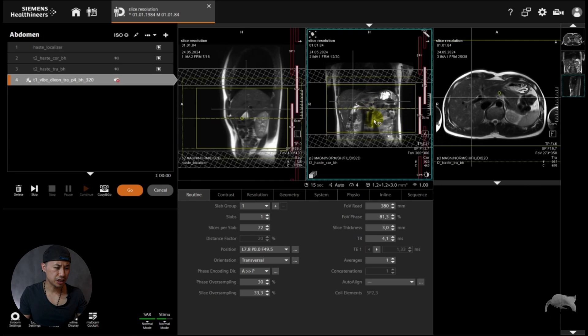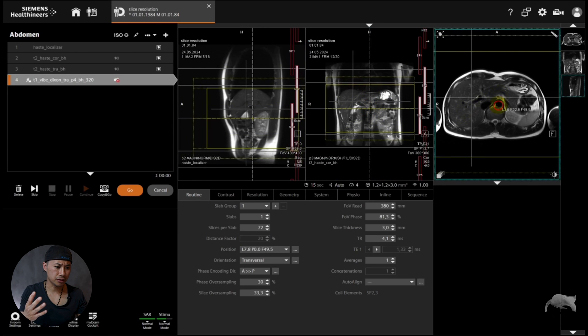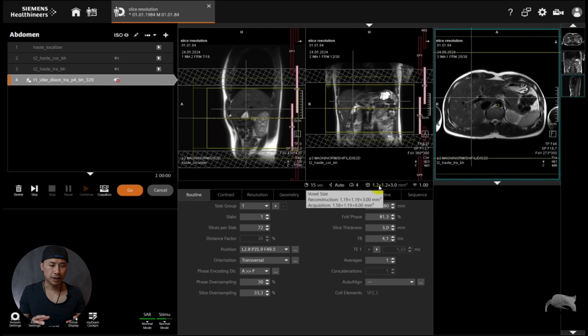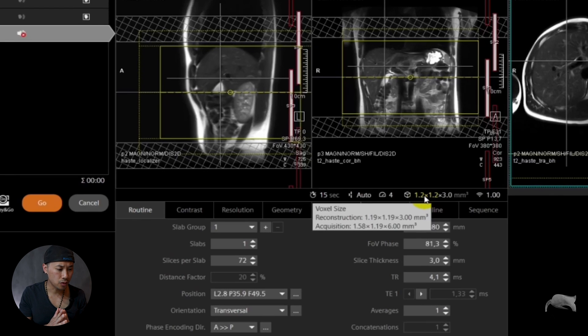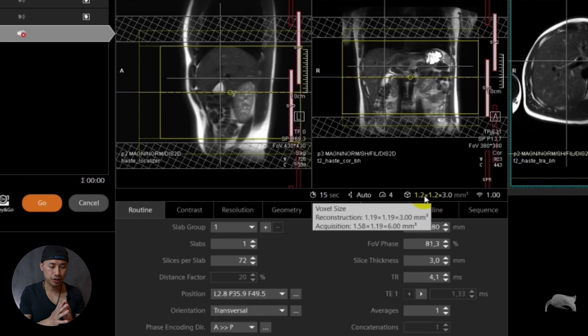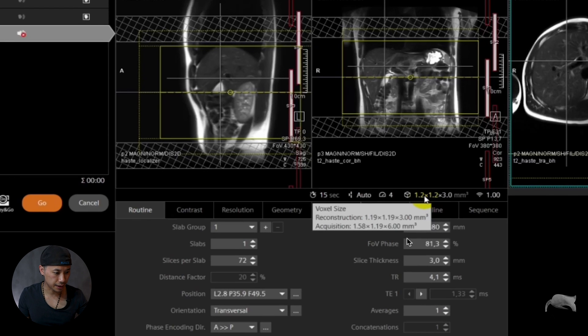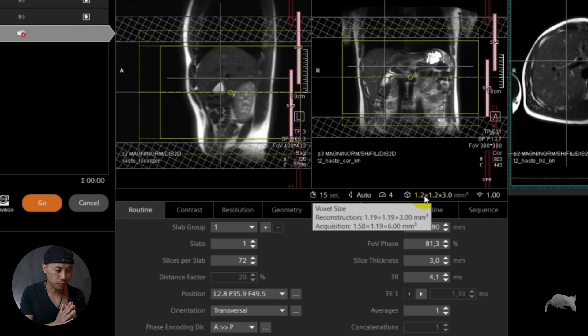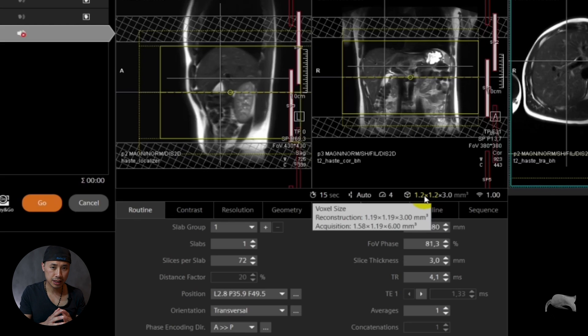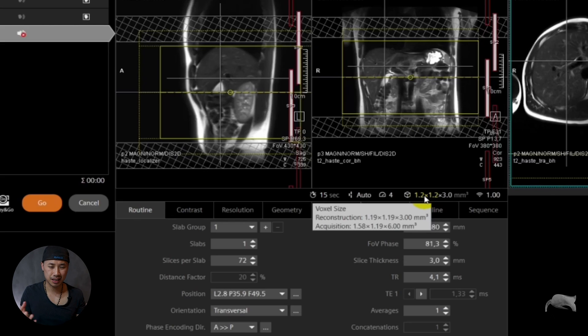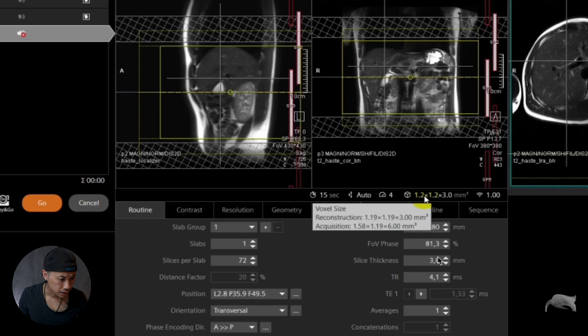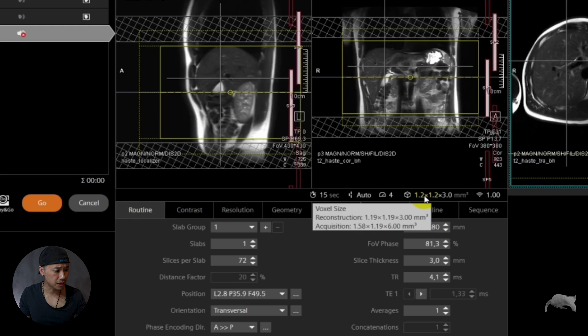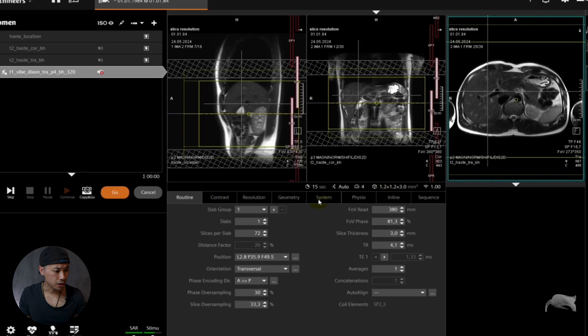Just try to tune in the position even though I'm not going to run the sequence. If we hover over the resolution up in the right corner, as you can see here, you have your mouse over here. Then you can see the acquisition is now for the phase 1.58, frequency 1.19, and then the slice is 6. How come the slice thickness be 6 when it says here 3 millimeter? Well that's what I'm about to show you.